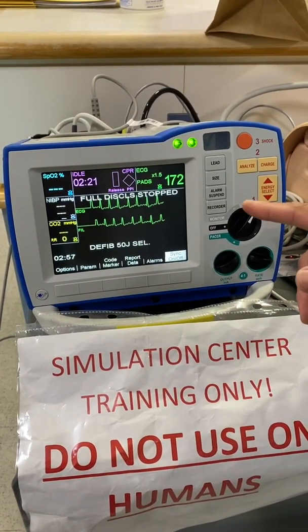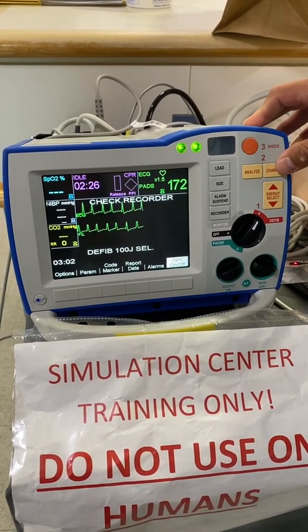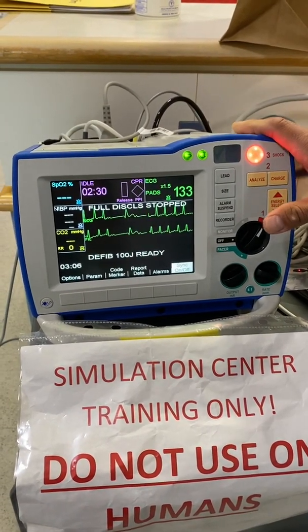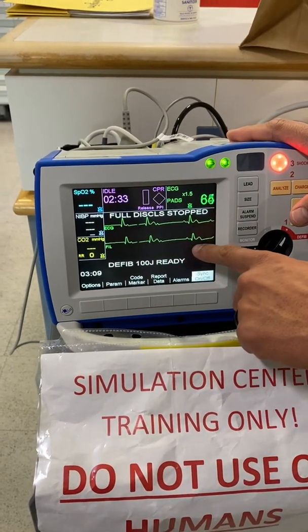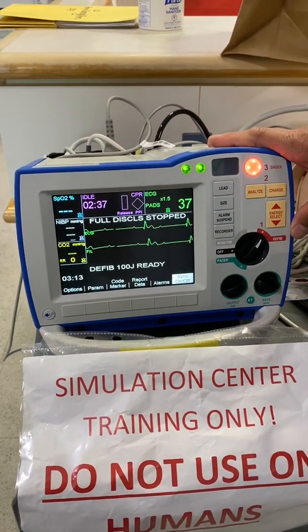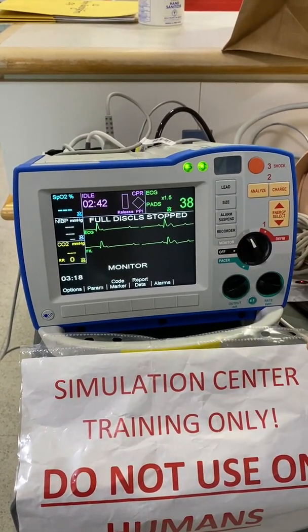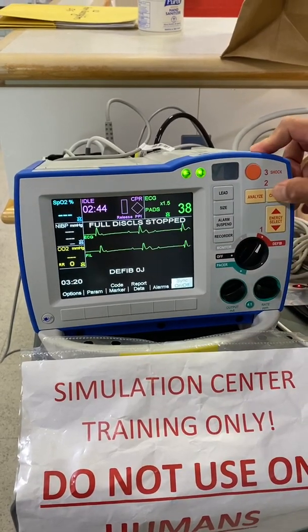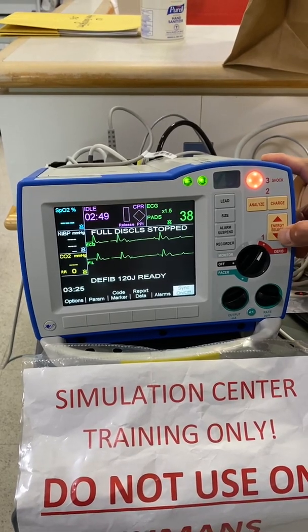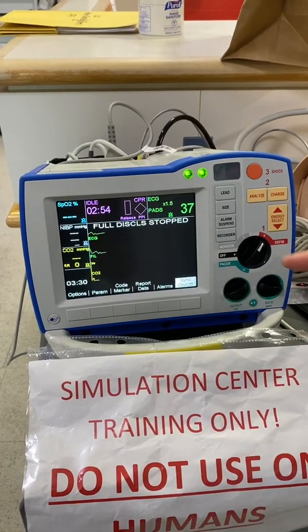We still have afib with RVR. Let's escalate the energy — go up to 100 joules. I'm going to charge, and I'm assessing it. I'm synchronized, but I see there's a rhythm change. That's not a shockable rhythm, so I want to disengage it. A couple of ways you can do it: you could flip this off, or — which I think is easier — just press energy up or down and it disengages the charge. It disarms it.